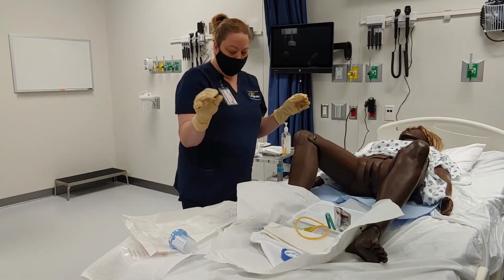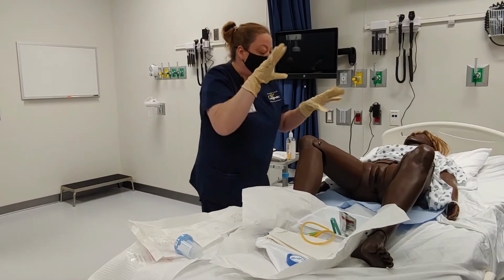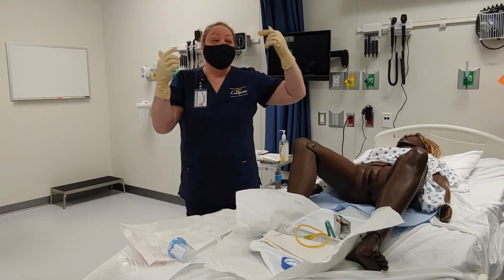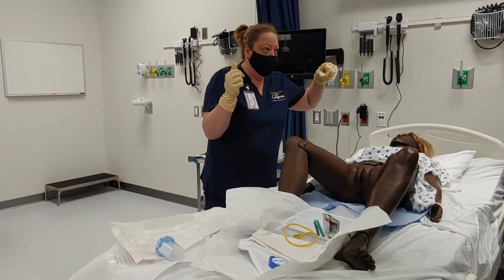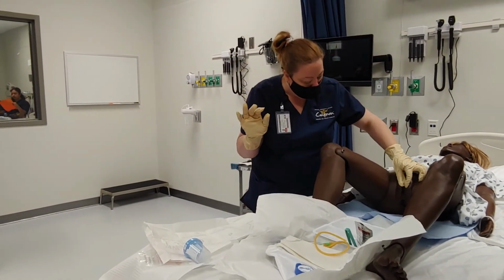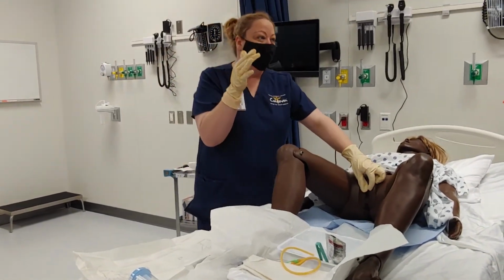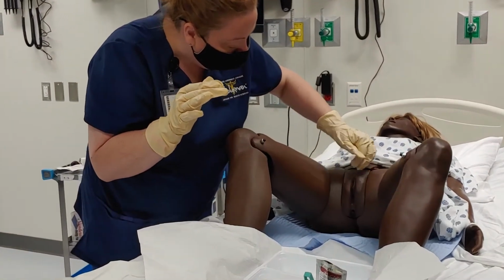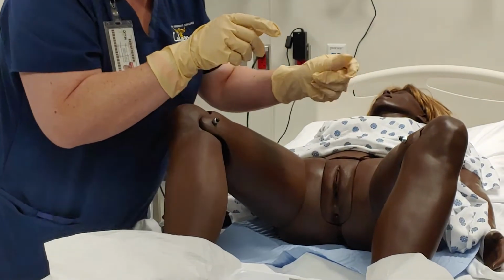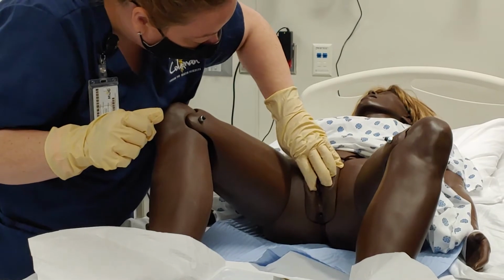Once I have this all assembled, now, still get sterile gloves on. Now what I'm going to do, my left hand, I am right dominant, okay? My non-dominant hand is now going to take and separate the labia. Trust me, on a real person, it's way easier. This is hard rubber, okay? I'm going to separate the labia so that I can see the urethra. And again, this is kind of hard material to hold separated, but we'll get it done.